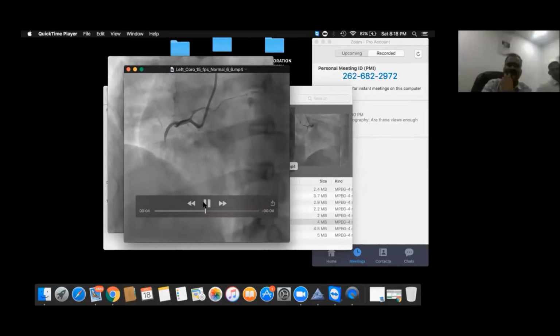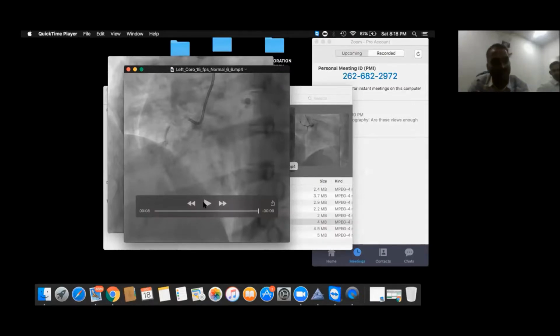So this is the picture. Can I end my angiogram, or do you want me to do something else? Say, for example, I completed the angiogram and came out. The patient is saying, I don't want CABG, I want PCI at any cost. What is the information which is lacking here?